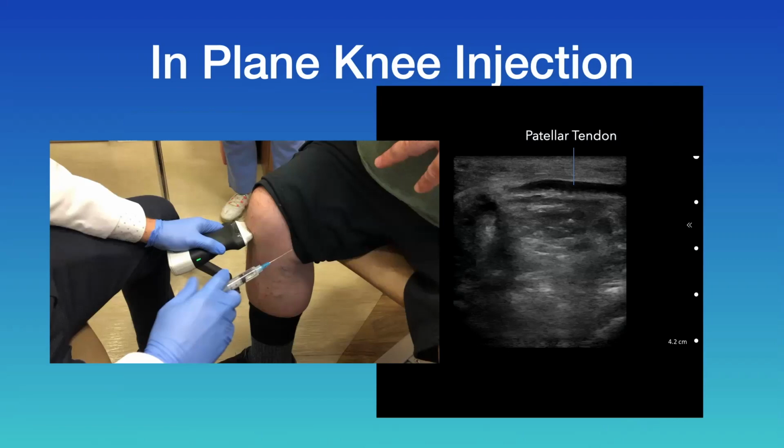And here is another knee injection in which I'm doing it in plane with a transverse view. By the way, the last probe I had a completely sterile covering on. This one I've been using for a lot of the images you see. I put Tegaderm on the edge of this type of probe, so it is sterile. However, the handle is not sterile.